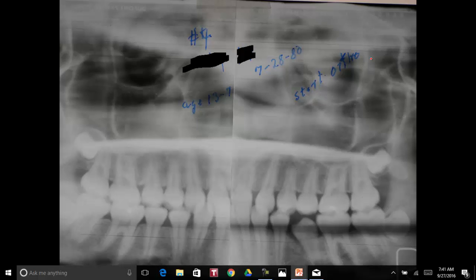Here is the panorex, and she was 13 years, seven months at this point. We still haven't done anything except just remove teeth on the case, and it's coming along quite good. This is 1980, so this is several years later, and we start the orthodontics at this point. So we've been watching this girl since she was six years old and had planned the diagnosis way back there. Now she's about 13 and a half. She's pretty well grown at this time.